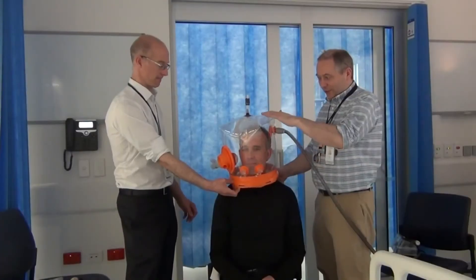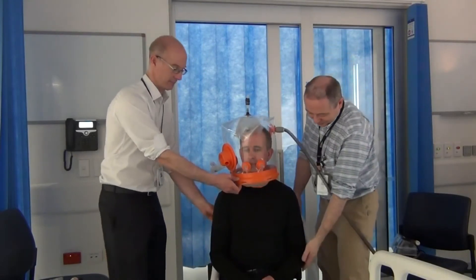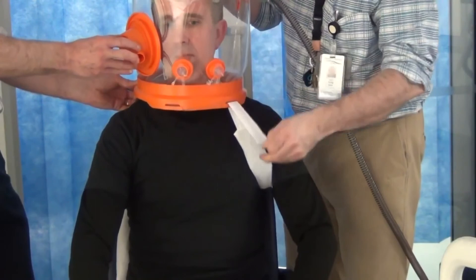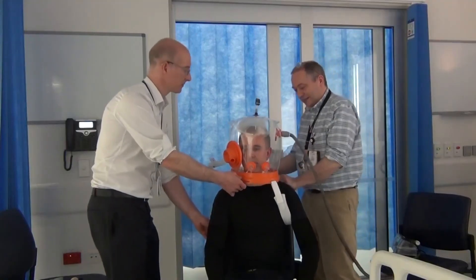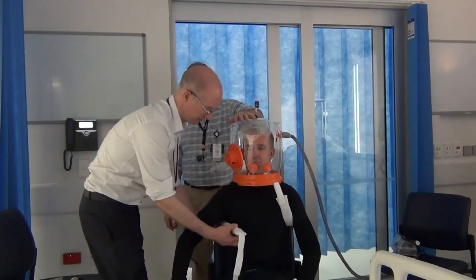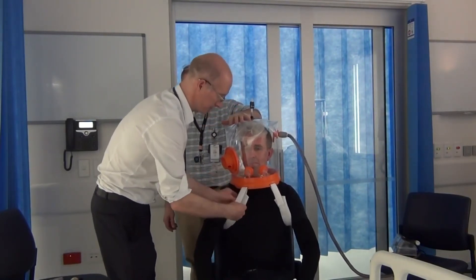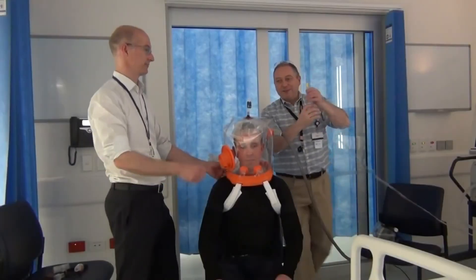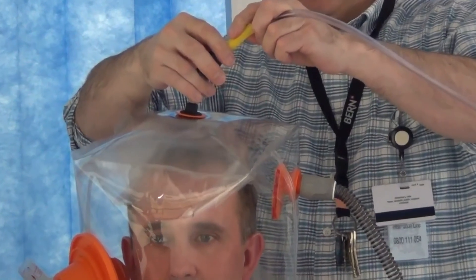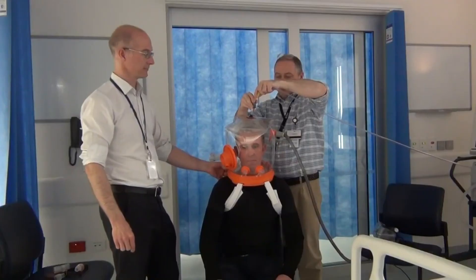The next thing to do is to apply the straps, finding the optimal comfort for the patient. Mark, can you lift your left arm up to the side and we'll just put one strap underneath and feed it through the ring. I'll just tighten the back slightly as well, and on the other side I'll hold the helmet while the strap goes in. I have my gas supply from the wall and we're gently going to inflate the cushion onto Mark's head. As we said earlier, this affords some comfort and also reduces some dead space in the helmet.